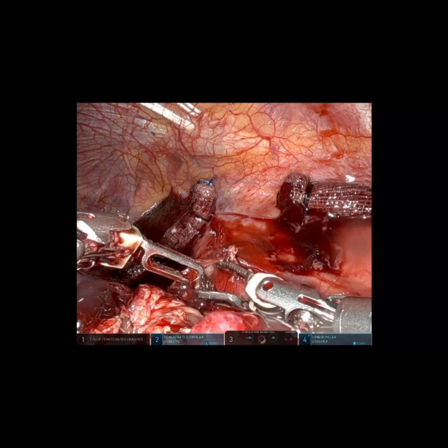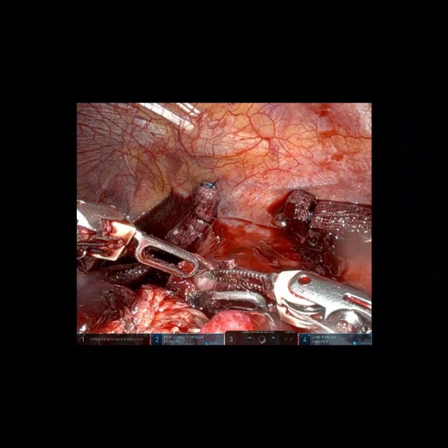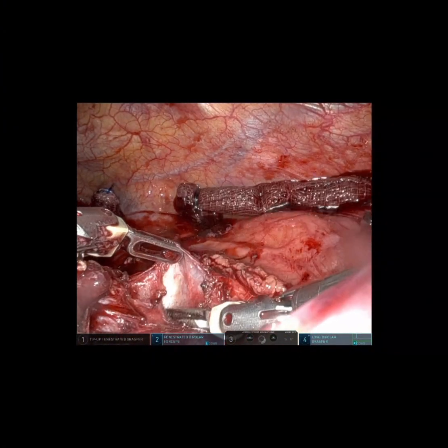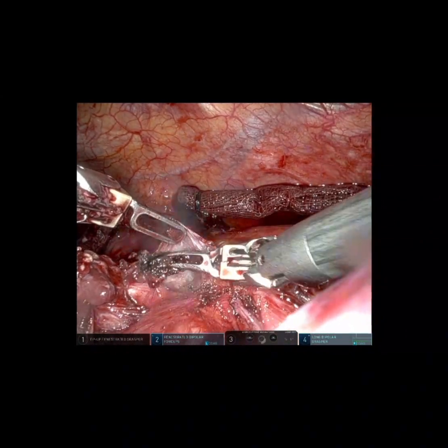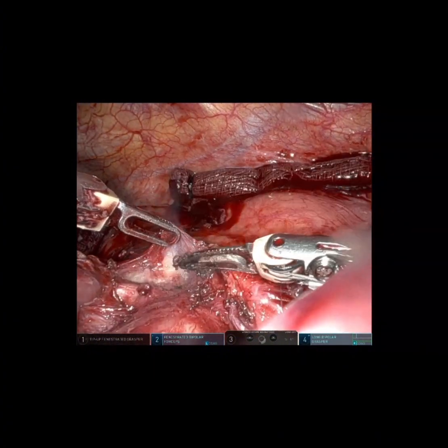So I'm not doing a great job here, let's be honest. That's me operating. It could be drier, could be faster. Okay, there we go. That's a little better. Now we're getting here, if you look at the 6-minute and 13-second mark, which is where hopefully you are, we're digging out. That's the A1, A3, and that's the azygos just under my left hand.